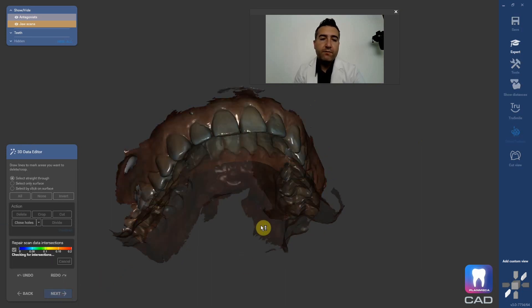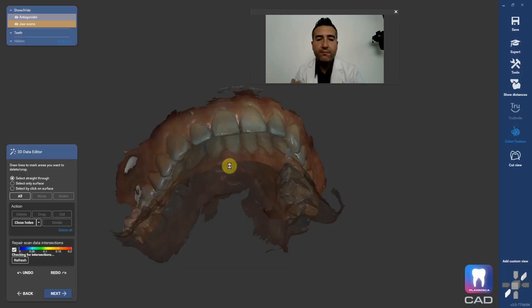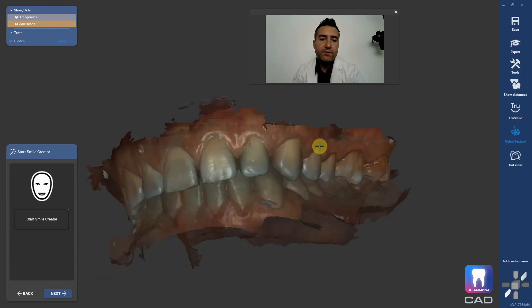Many digital impression softwares will over-articulate the jaws ever so slightly. ExoCAD does not like that. Here it's saying I have over-articulation of 400 microns. I'm just going to hit 'don't modify the scan data' because I don't care. And that's it — now we're off to the smile creator.